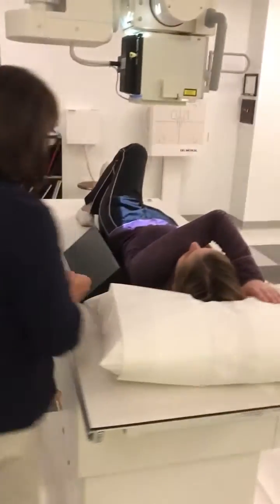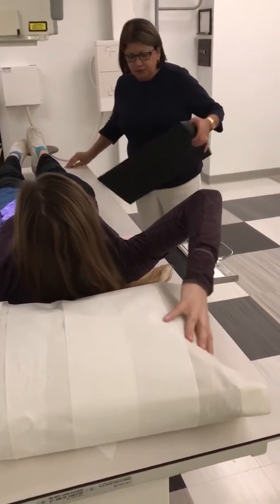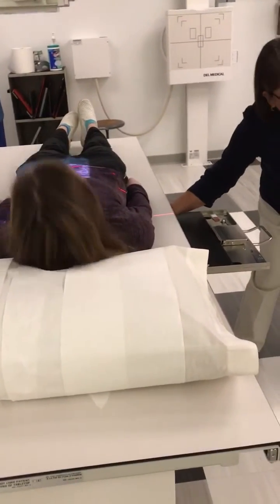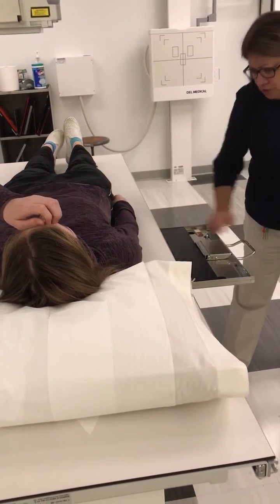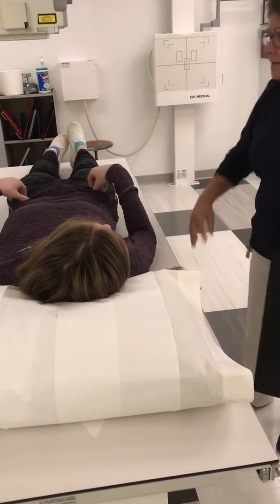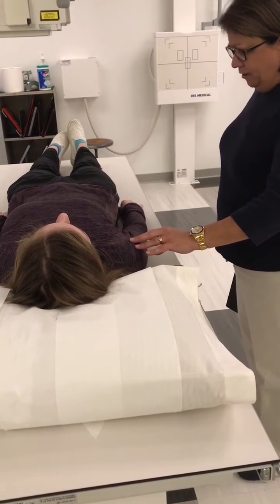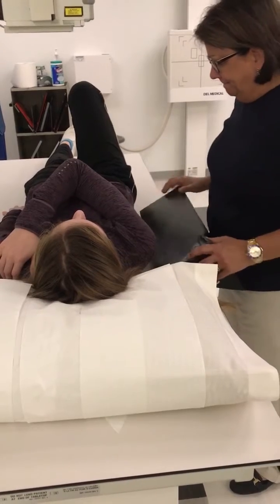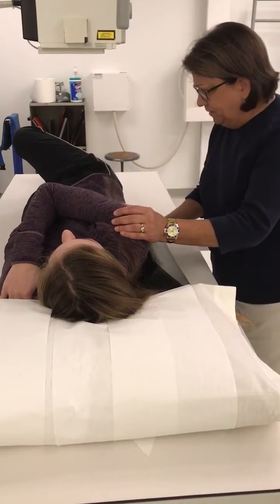I'm going to remove this sponge from behind you. Go ahead and lie flat. Scoot toward me just a little bit, please. Once again, you want to make sure your patient's straight on the table. Now for the LPO, I'm using my left marker placed inferiorly to the outer edge. Bring up your right arm, put it across your chest. Raise your right leg. I'm going to roll you a little bit to the left. Put the sponge behind you.